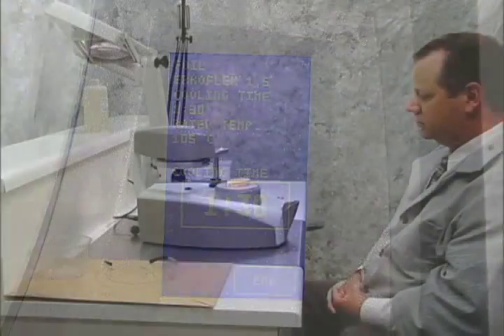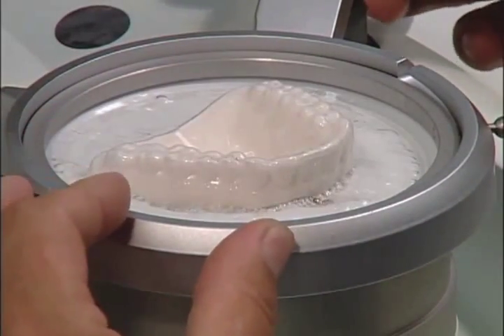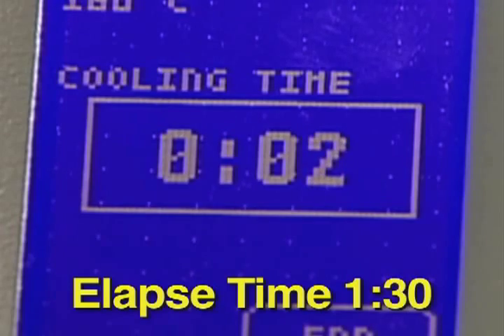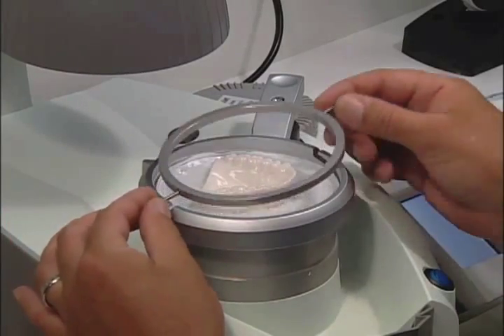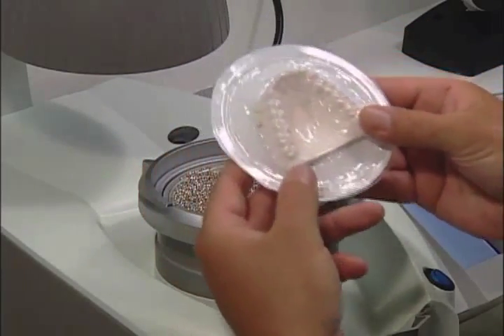Once the correct temperature is reached, you will hear a continuous signal and then the heating unit will turn off. Rotate the foil reception away from the heating unit and immediately over the model. Firmly press down on the foil reception to complete thermoforming. The cooling time will begin to count down. When completely cooled, remove the foil securing ring and take out the model with the foil disc. The thermoforming is now complete.